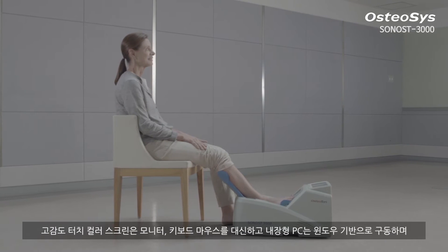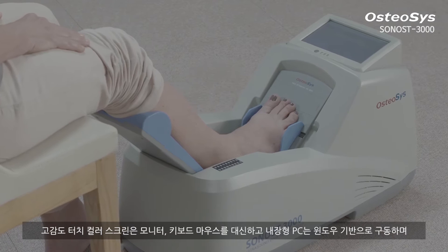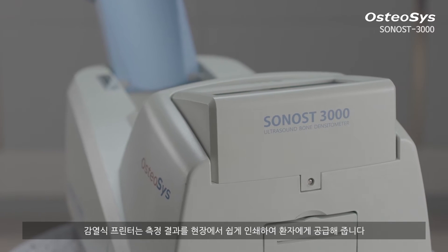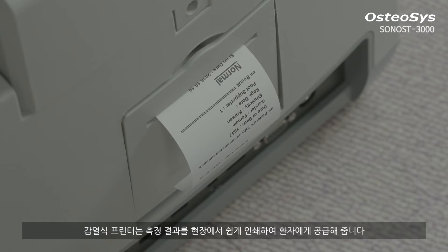Sonos 3000 offers a comfortable and easy to handle measurement through its high-sensitive touchscreen without an external monitor or a keyboard. Moreover, the built-in thermal printer prints out report cards in a simple format to cut down maintenance cost.